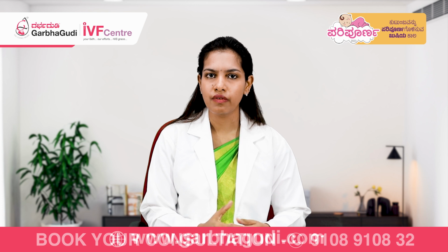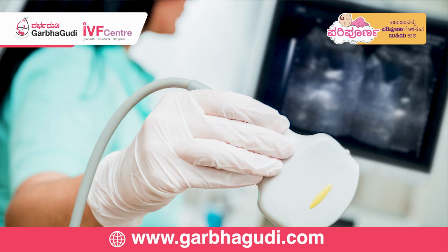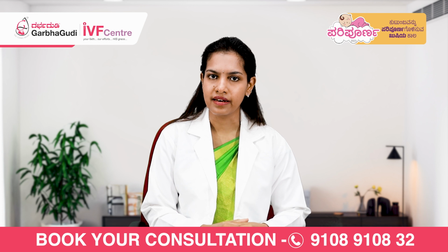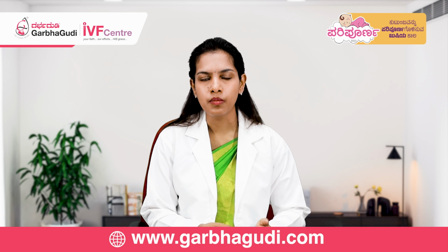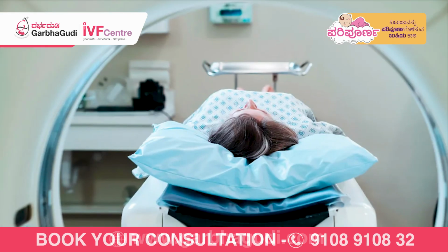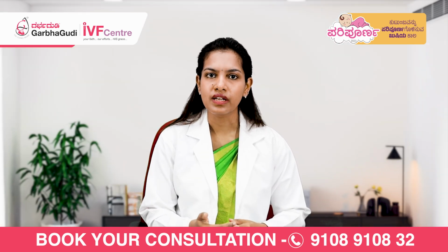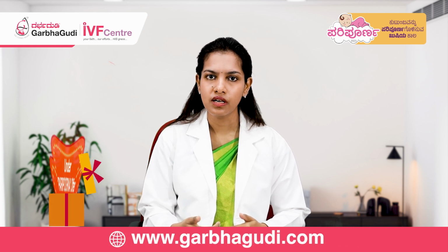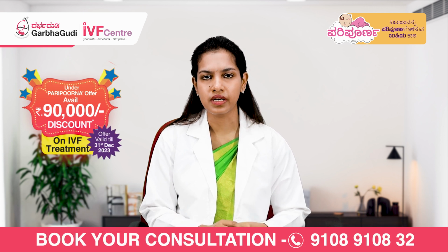Usually when couples come to us with fertility issues, we subject the female partners to a transvaginal scan wherein we see the uterus and the ovaries. Suppose on this scan we find any abnormality like I already mentioned, like a fibroid or a polyp or a septum or any evidence of adhesions, then we confirm it with a 3D scan or an MRI, and then we post them for this procedure called a hysteroscopy, wherein we can confirm the diagnosis, and also if we find a polyp, a polypectomy can be done. If we find a fibroid, resection can be done, and any septal resection also can be done.